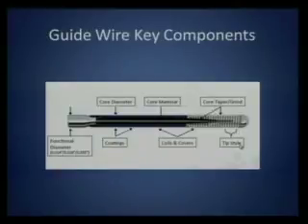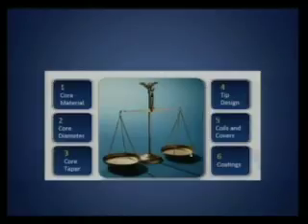By varying these components, you can get different types and characteristics of wires. Every wire behaves differently. There is a different wire for every access. If I want to access a small vessel which is curved, I'll use a different kind of wire than I would to access a big vessel which is straight, okay? All of this depends on the wire components. There are basically six things that you can change in a wire to get different qualities: the core material, the core diameter, the taper, the tip design, coils and covers, and coatings.